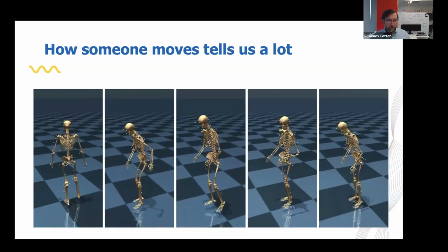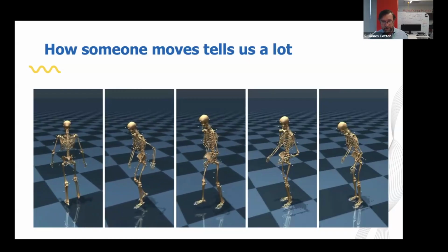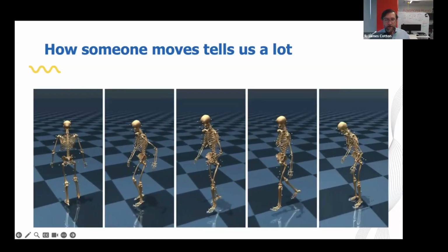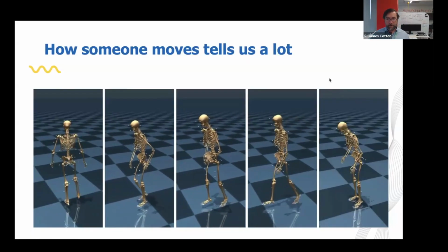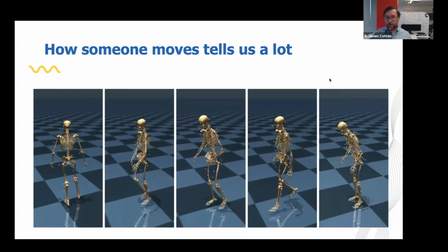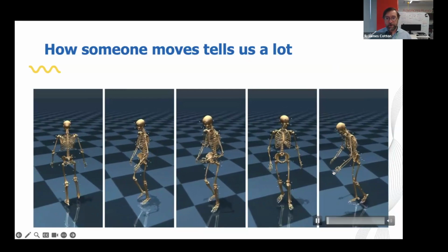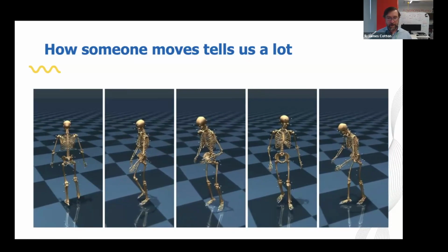And here's an individual with another stroke who's slightly less impaired, with the asymmetry affecting the other side. Then this individual looks relatively unimpaired, but if you watch more closely at their trunk and arm symmetry, you can actually pick up a little bit of an asymmetry, and this is a transfemoral amputee using a prosthesis. And finally, this last example is someone with a spinal cord injury using a rolling walker. They've got adductor tone. You can see that kind of scissoring like that.